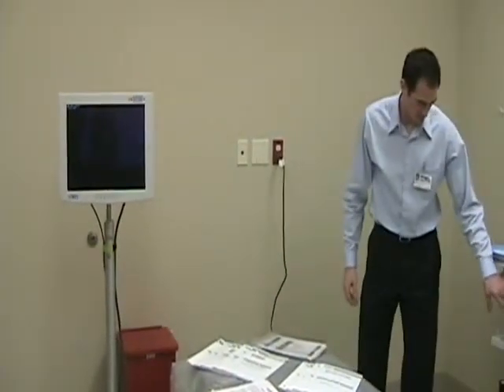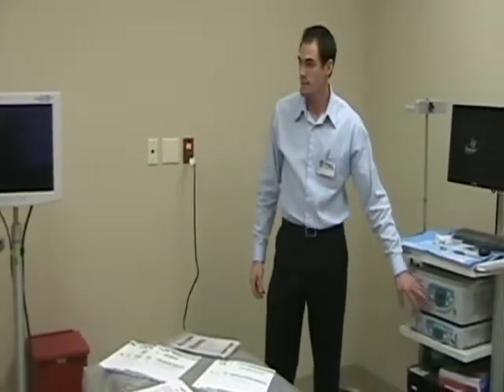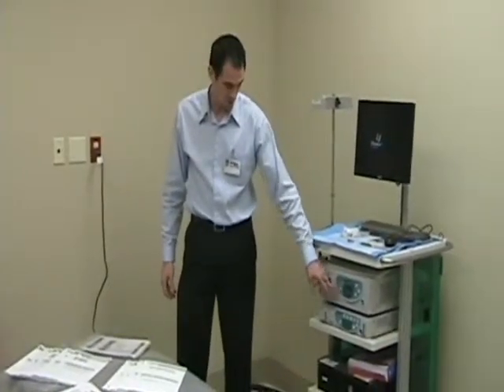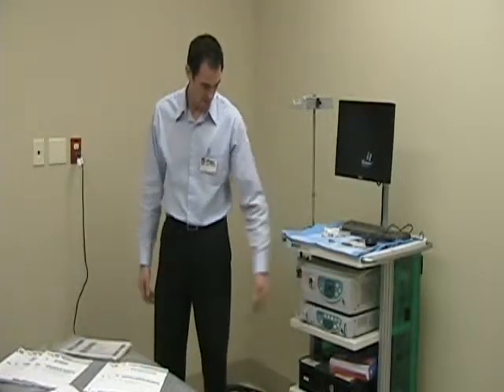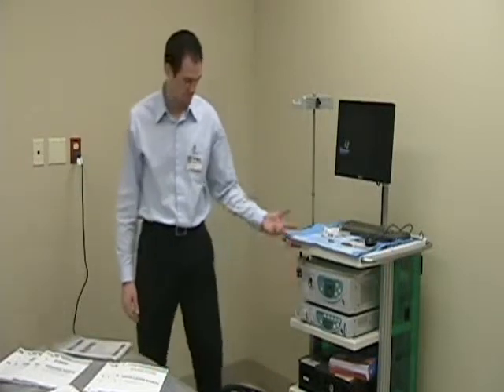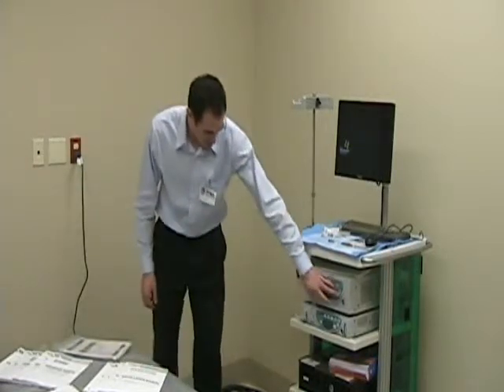Anyways, you can hear the pump going right now. There's 2 settings on here, high and low, or normal and low. So you can hear it, that's normal, which most people function with. If you like to ride the air, sometimes turn it down so there's less air being pumped inside. And then for purposes of talking, we'll just leave it off. So you can turn it on. So, anyways, pretty simple setup here.